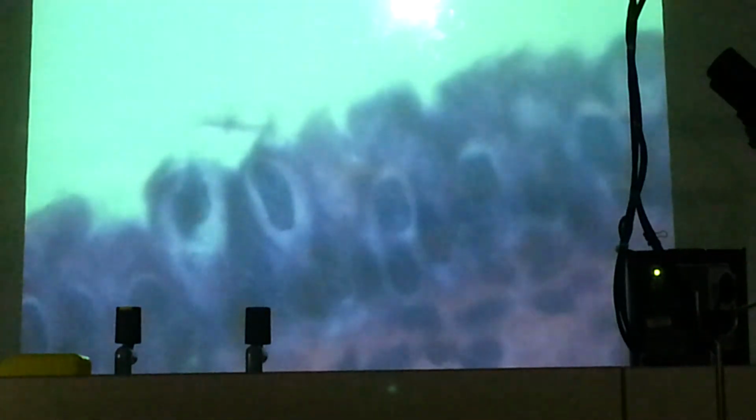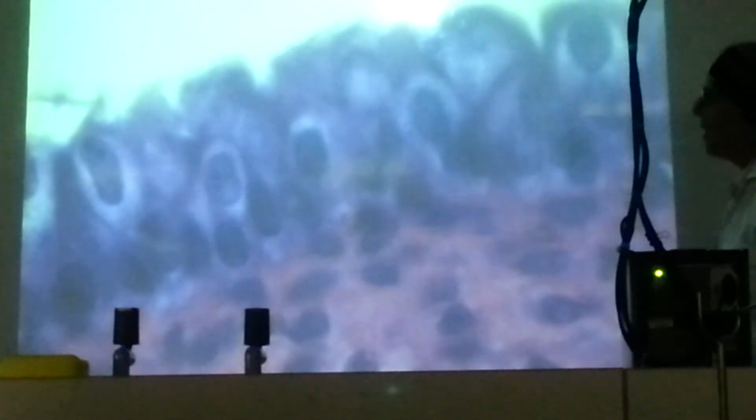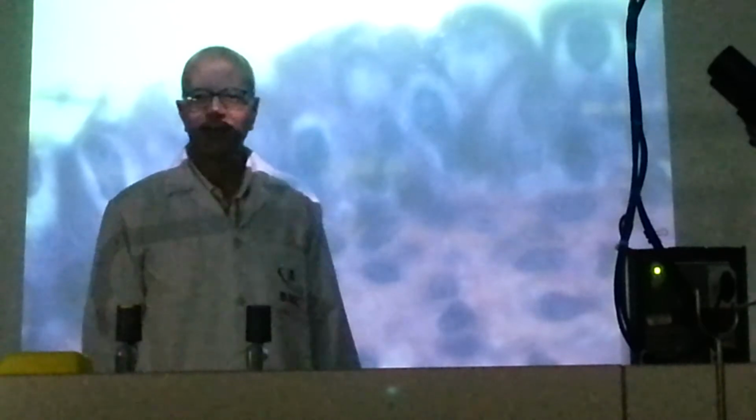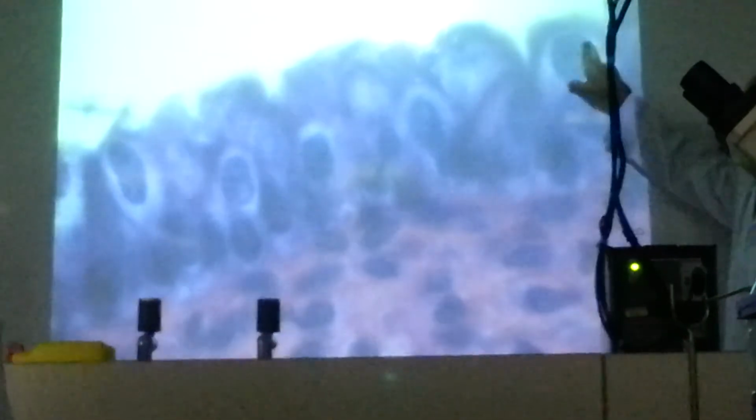Okay. What is the name of this type of epithelium? I hear someone saying the right name. Okay. It's stratified. Why? The nuclei are different in different levels, so the cells are present at different levels. As regards the nuclei reaching to the surface, it's stratified epithelium. Which type of them, according to the shape of the superficial cells? It's cuboidal or broad cuboidal with rounded nuclei.